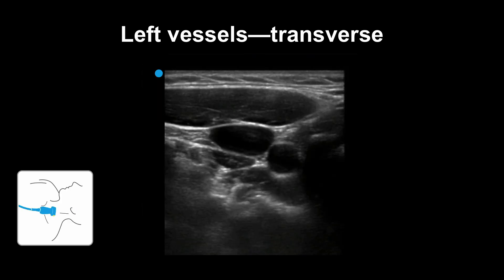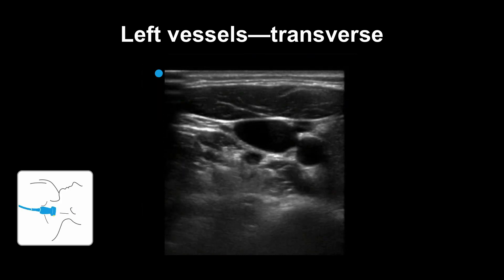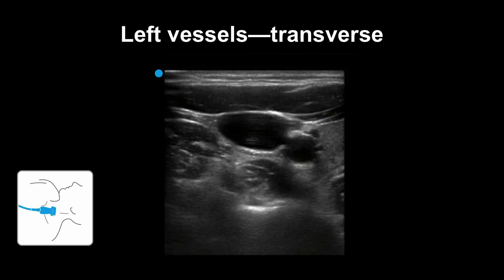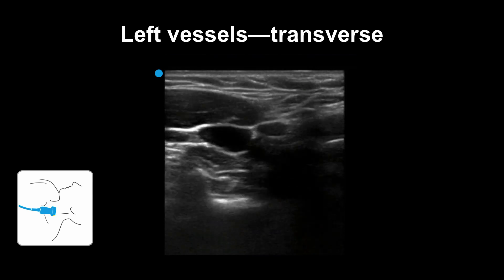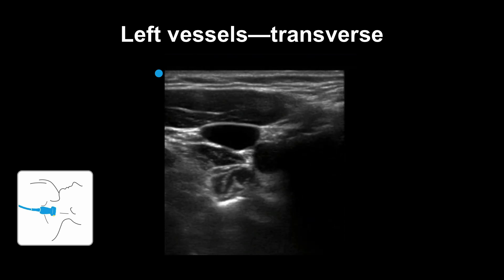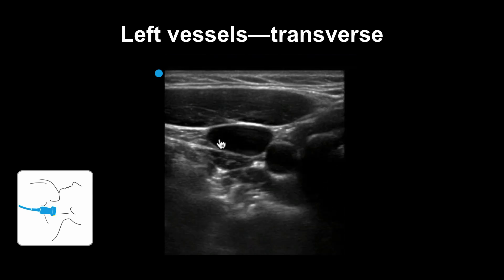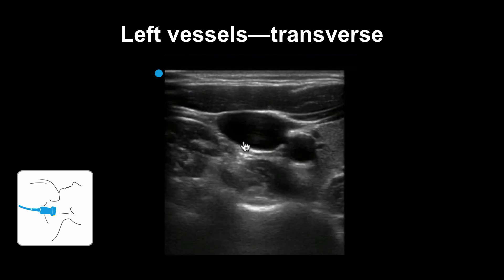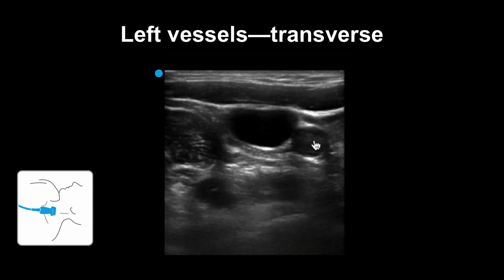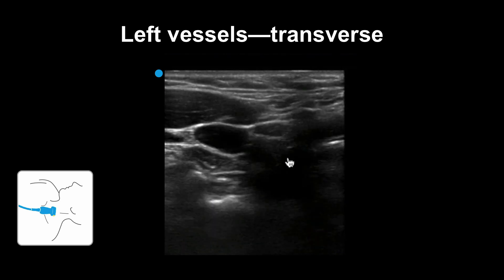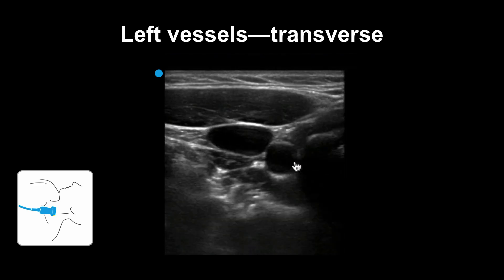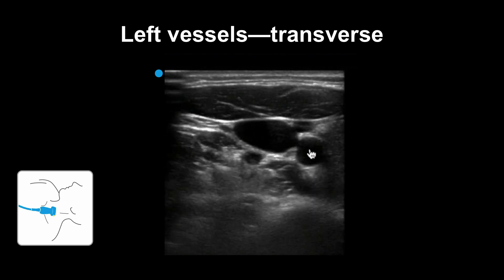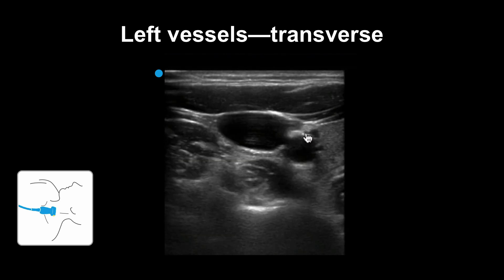Here you can see the relationship between the internal jugular vein and carotid artery on the left side of the neck. Here is the vein, more oval and thin-walled, compared to the artery, which appears medial, more round, with a thicker wall.